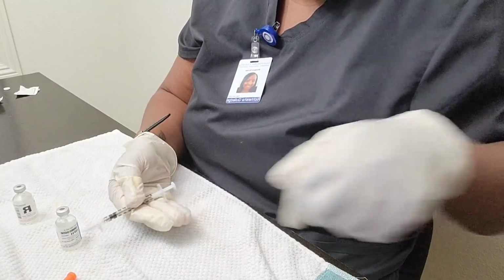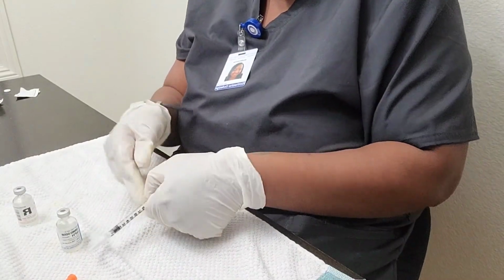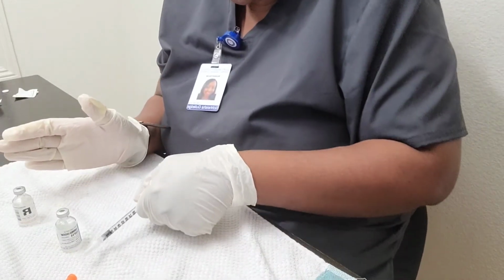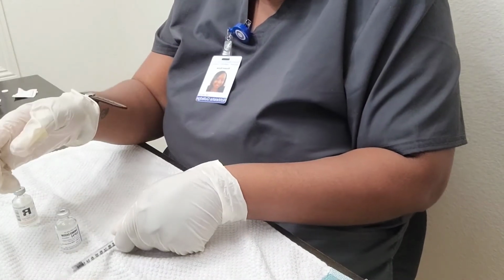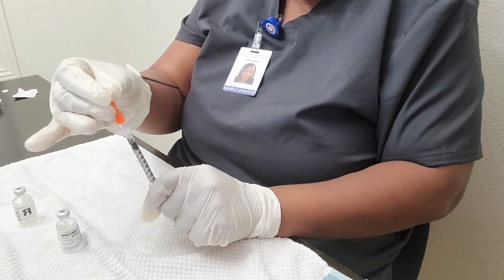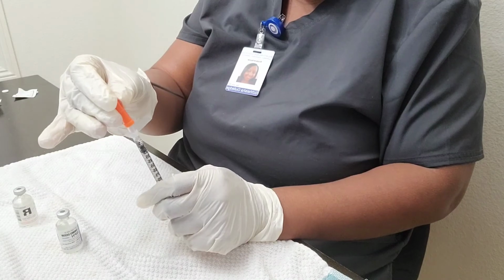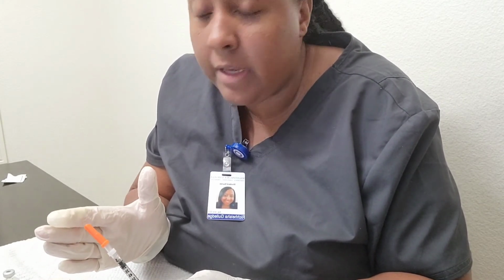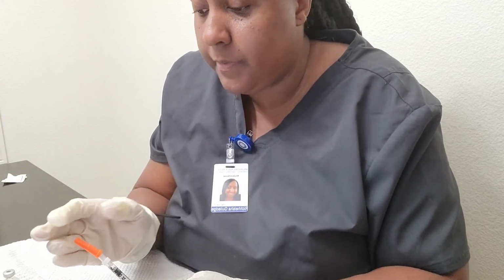Then I will recap it. If I'm not doing this at the bedside by the patient, then I will label it with the patient's name and the dose.